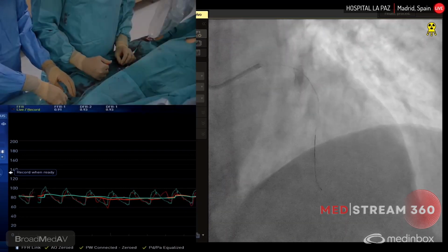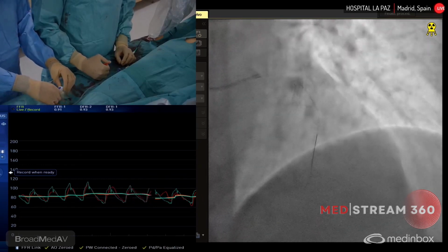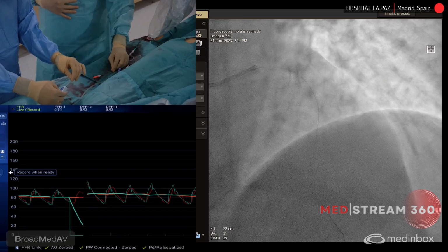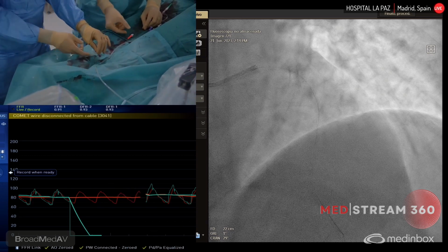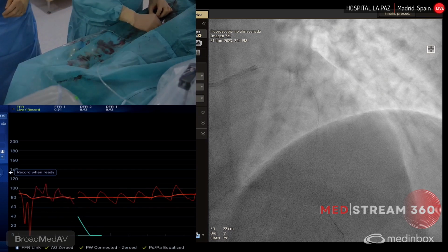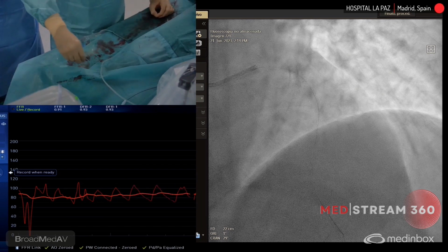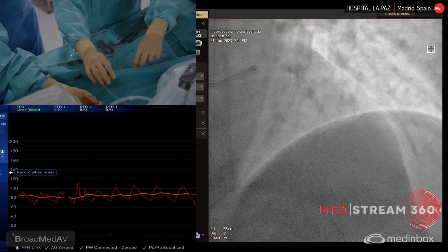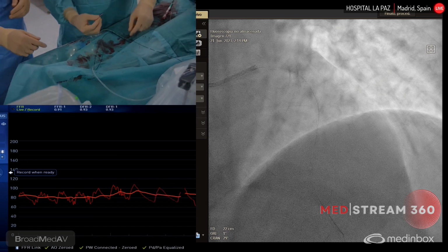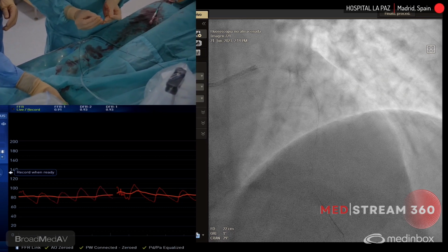We can disconnect this, no? To be more comfortable. Yeah, you can disconnect to perform the OCT. I don't know if you are seeing my hands with the camera. Look, this is quite easy. You push the button, and this is disconnected, and it's the same to connect again. So we're using this wire to perform the OCT and eventually the PCI if it is needed. This is a crucial part of the study. We are doing the OCT, and then the analysis of these results is crucial to include or not the patient in the study, because it needs to have some criteria of vulnerability in the plaque.